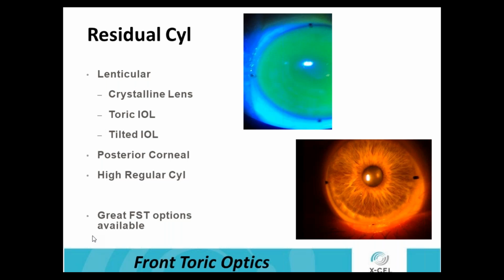So when we have that residual astigmatism, we've got to make sure that it actually is residual astigmatism. It's not one of those things where we go to it often, because we're fitting mostly irregular corneas, which is corneal astigmatism, and we're correcting that with the lens. But when we see it, we use the toric haptics for a front surface toric.